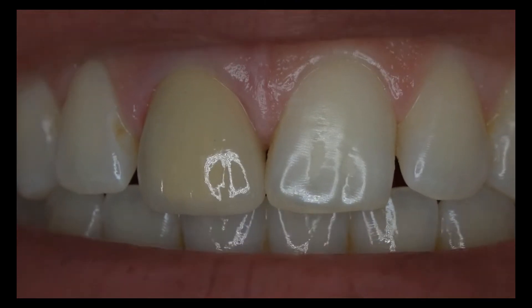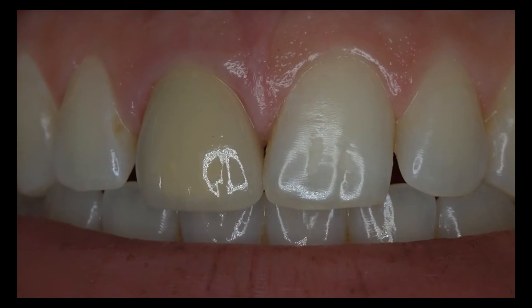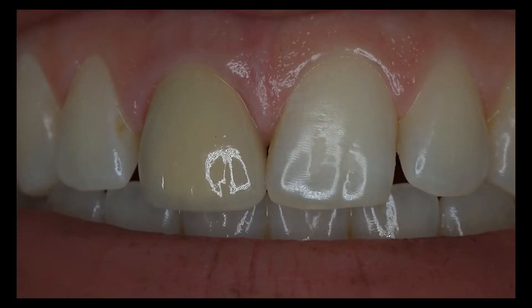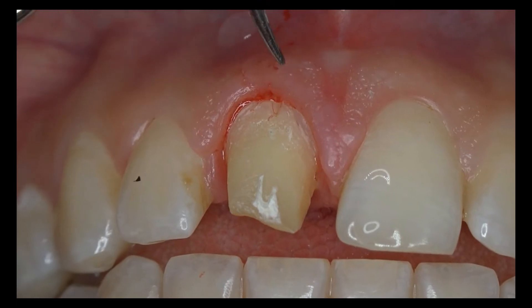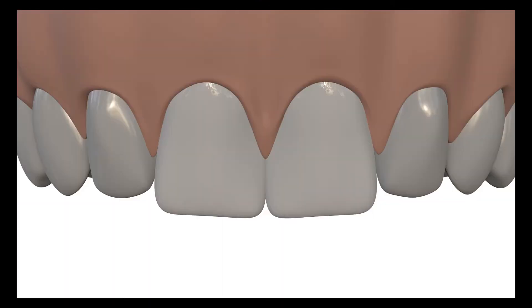In the present case, color mismatch together with asymmetry in gingival level and emergence profile exists in the maxillary right central tooth restored with a metal ceramic crown. The gingival level is 1 mm below the left central tooth, a black triangle exists at the papilla between the two central teeth, and the crown is narrower than it should be at the distal embrasure region. All problems related to shape can be resolved with small modifications during tooth preparation without any surgical intervention on the soft tissue.